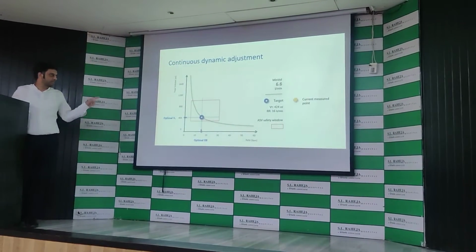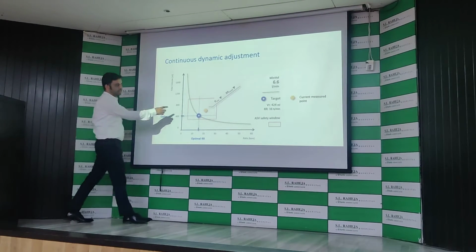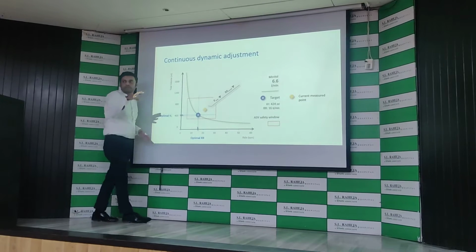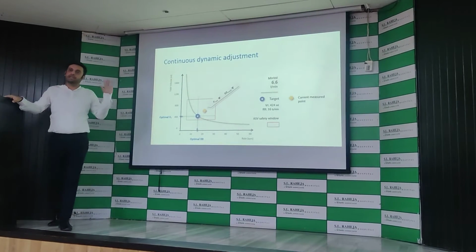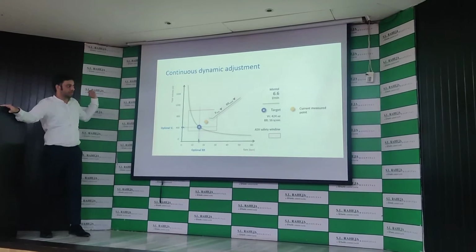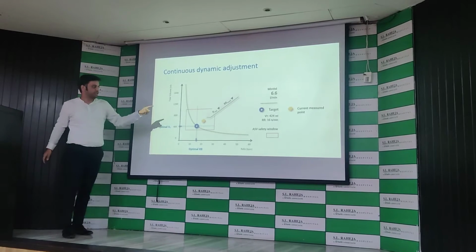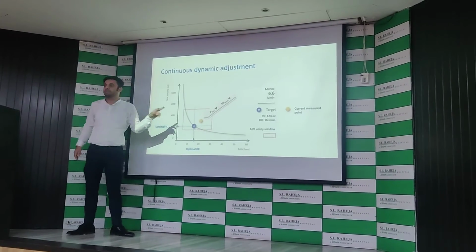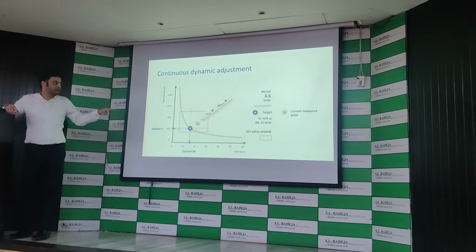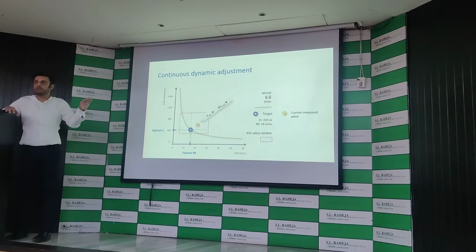Now here is the safety box, what we always say. If your plus sign is ranging in this box, that means your minute ventilation is achieved. Not totally, but it is at least safe. But if this is going outside the box, that means it is not safe. And automatically the square will also change. It will turn to a rectangular vertical form or a horizontal form.